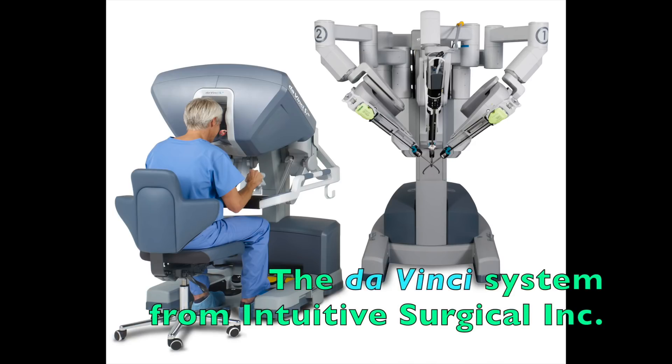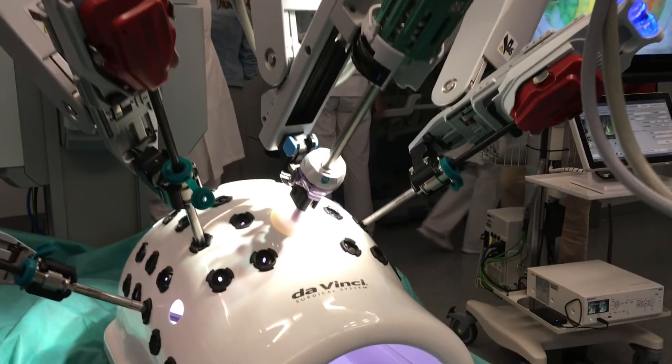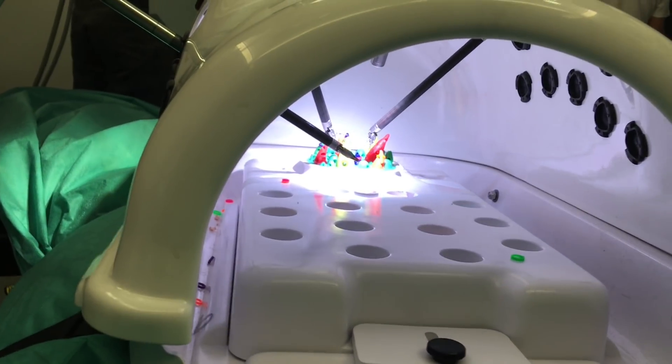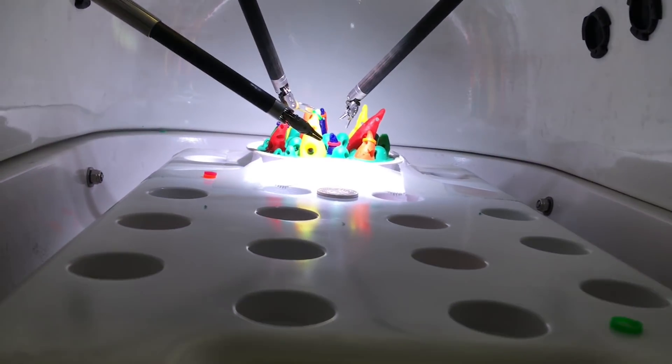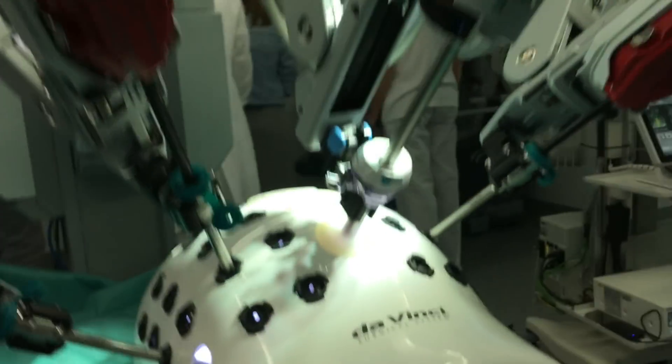Not playing with junk this time. Open house at the hospital winter tour and they let me play with this thing here — it's the da Vinci surgical system, set up with an exercise dummy that represents a human torso with some gummy bears inside to practice.